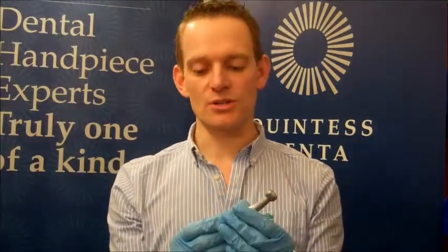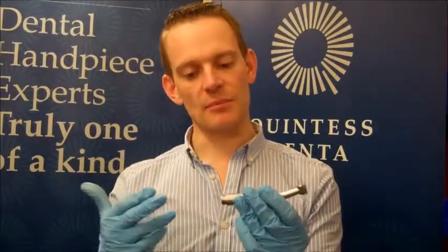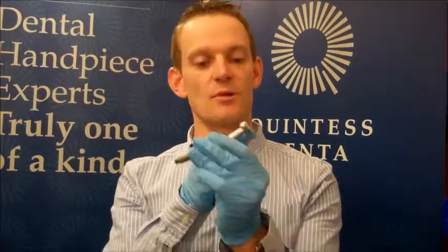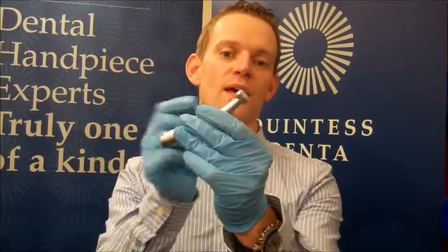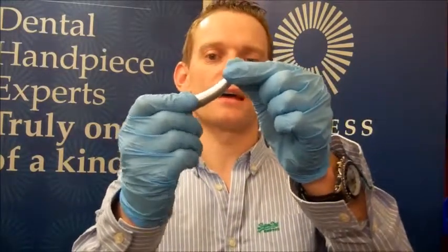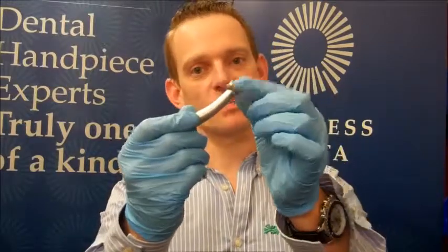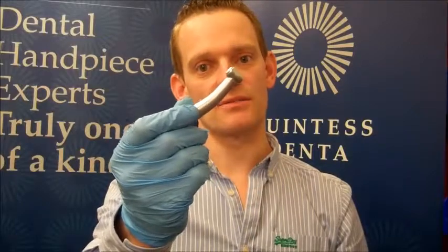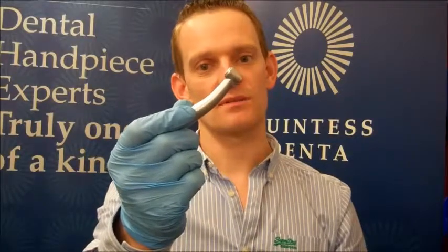So the first thing we want to do is apply lubricant oil to this handpiece to remove as much dirt and debris from the head as we can. What happens is, if we have a build-up of debris inside the head, it causes a build-up of heat around the bearings. That causes them to fail prematurely. Okay, so we don't want that happening.